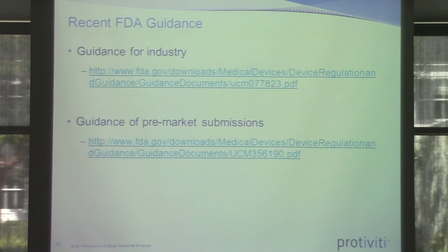I think the driving force where there's really going to be leverage is, and there's quite a few, Mayo is an example, they've come out many times now and said that they're working on it, during that procurement process for the healthcare organization, writing in best practices during procurement and what you can do from a buyer perspective before you purchase the product to push back on the manufacturer. So that for the manufacturer, it then becomes a requirement. Really, that's changing the industry. The FDA could come out tomorrow. I mean, if an event happened that was bad enough, there would be regulation tomorrow, and then everything would be getting tested. Getting tested improperly, probably, but it would be getting tested.